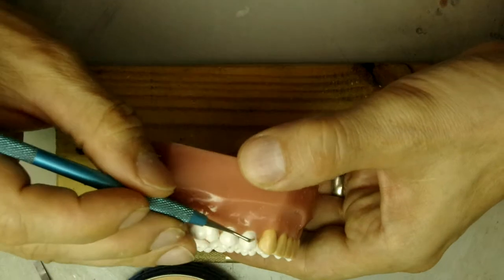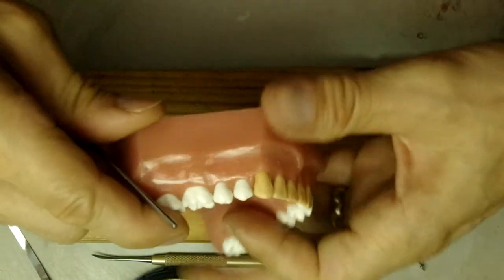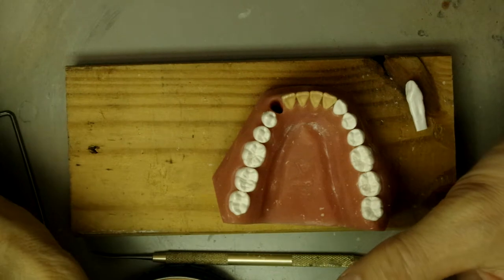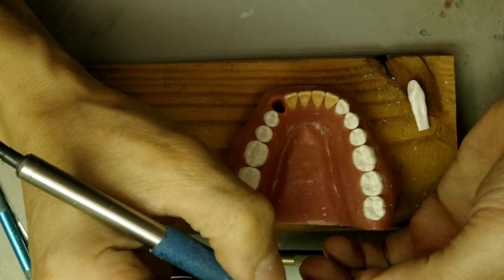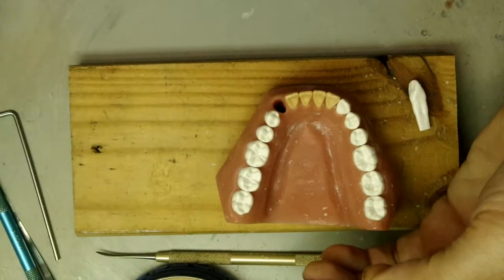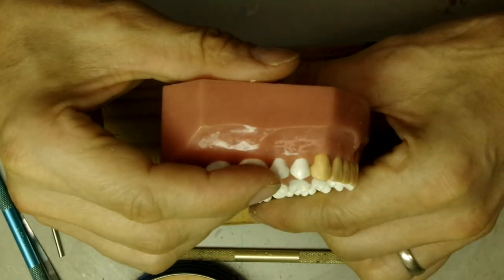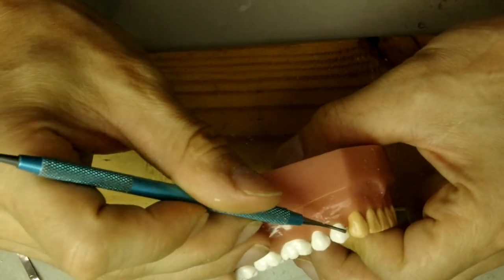Now here I have a gap, so we're gonna need this to be contacting, so we're gonna pop it back out, because if that doesn't contact, points off. So we'll add a little bit more, which actually will help us because it will make this tooth a little more round on the distal. Let's see if we added enough. Yeah, just enough. There's a little bit of extra wax there, so we'll take it out.